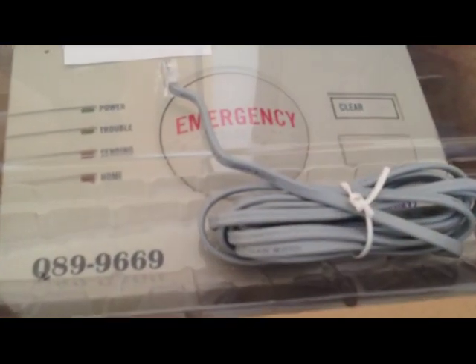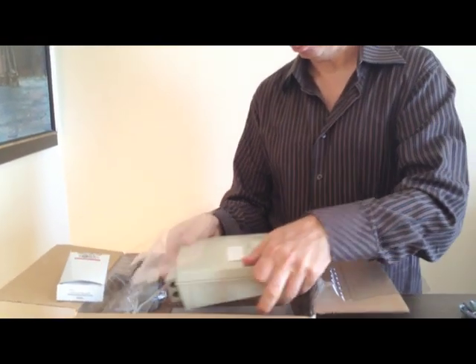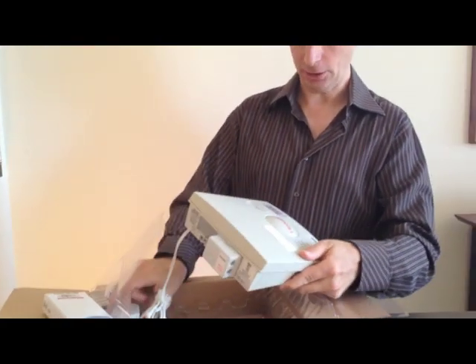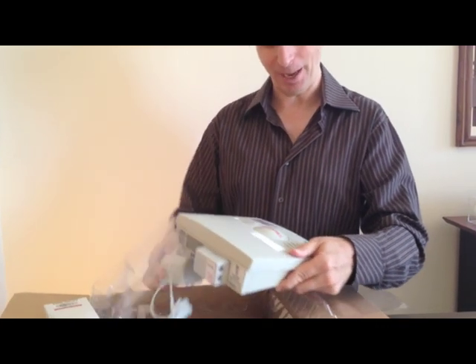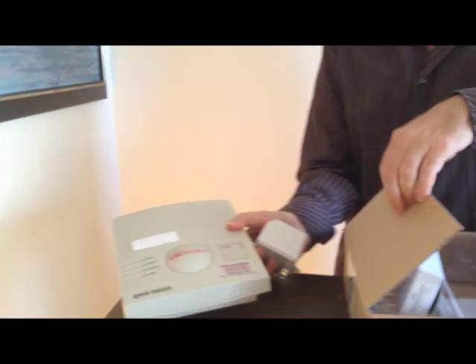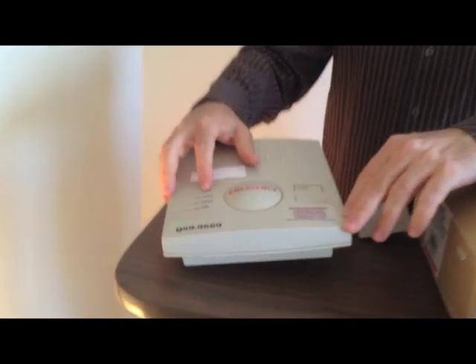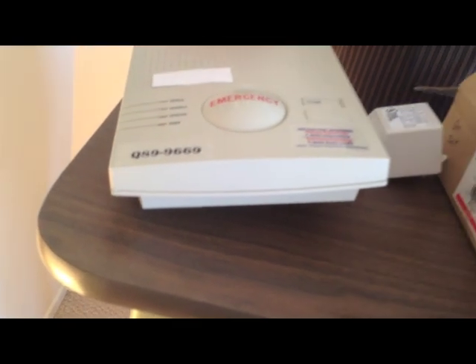And now the unit itself. The base unit is a good size — it's larger and heavier than what we've seen in the past. But it's got a nice big emergency button, and also status buttons here that tell you what the system is doing, which is really nice. Not everybody has them.